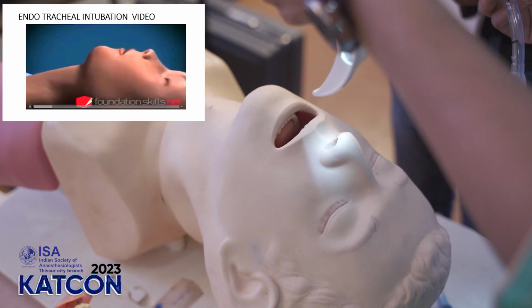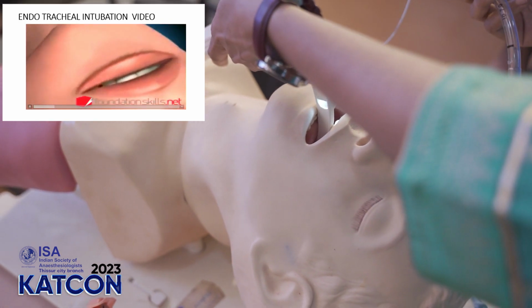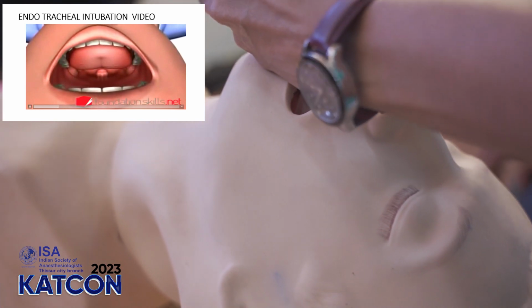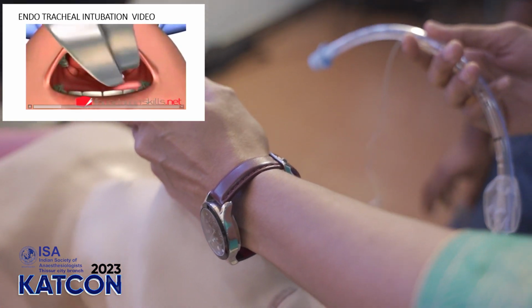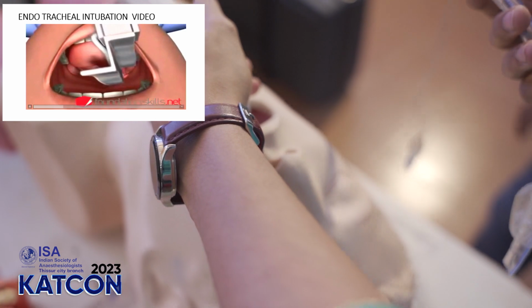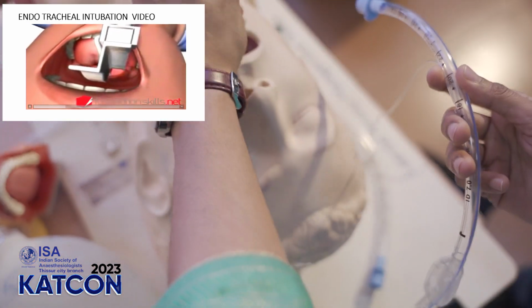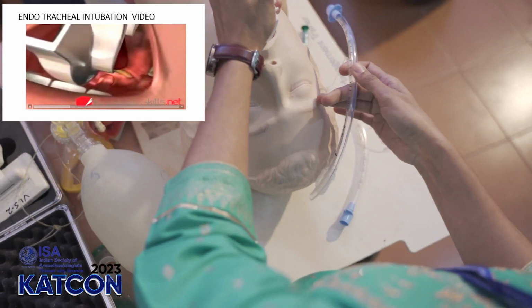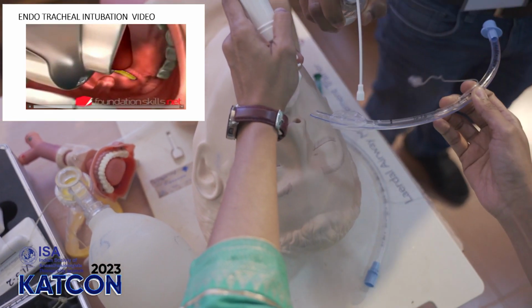Standing behind the patient with the head in the sniffing the morning air position, with the left hand, insert the curved blade of the laryngoscope into the patient's mouth over the right side of the tongue, displacing it to the left. Following that, we'll open the mouth. Advance the laryngoscope slightly and upwards. The tongue will be pushed onto the left side until the tip of the epiglottis can be seen posterior to the back of the tongue.